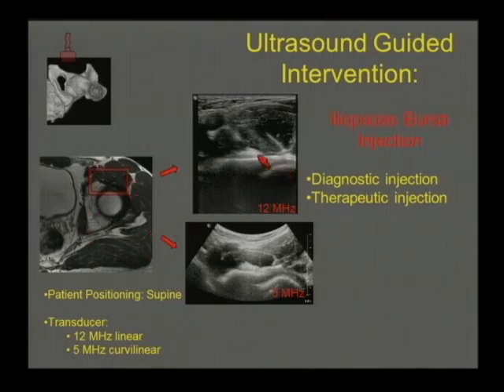So after identifying the tendon, I turn the transducer so that it's transverse to the patient, and then come a little bit proximally. You have a nice landmark with the femoral head, and you want to bring the transducer proximally enough that the femoral head is out of view, and that ensures that you're looking at the tendon over where you can easily access the bursa. There's a nice bony backstop where you're going to be doing your injection. That also ensures that you're not going to accidentally put the needle into the joint, to try to get the medication exactly where you want.